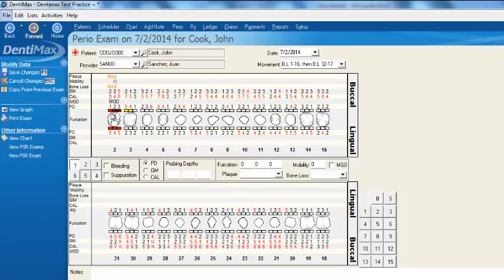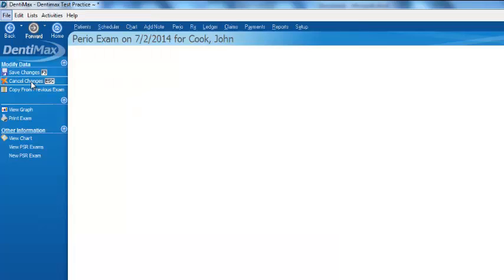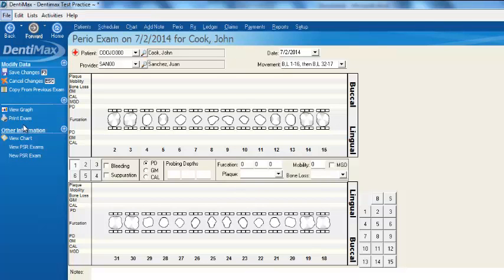If I'd like, I can go ahead and modify those measurements. That's one way of doing it. I'm going to cancel out of that screen just to declutter it, then click on new perio exam to have a nice, fresh, clean exam.